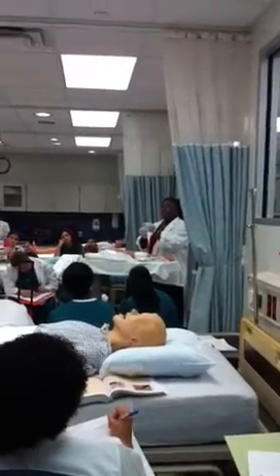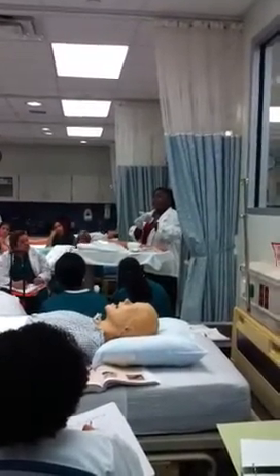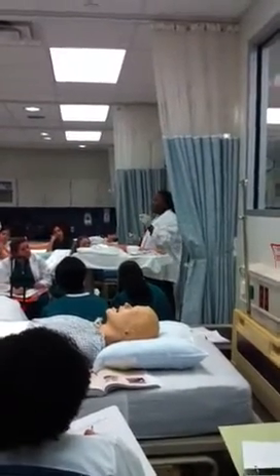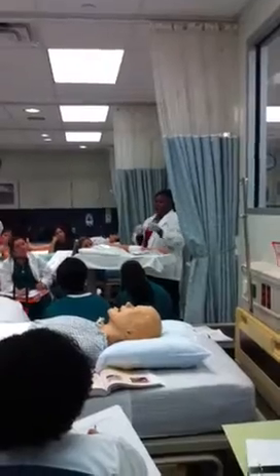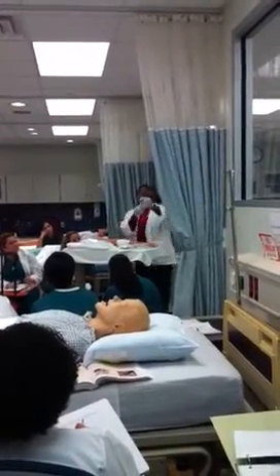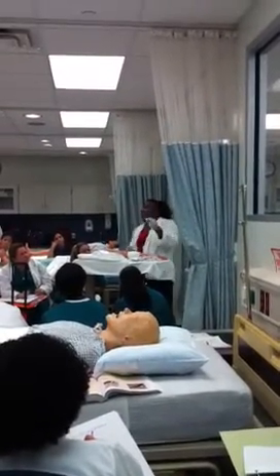I'm going to draw 10 units. Whenever you draw from this vial, you need to instill the same amount of air as the volume you're going to administer. 10 units. You notice where I'm holding? I'm not touching the plunger.